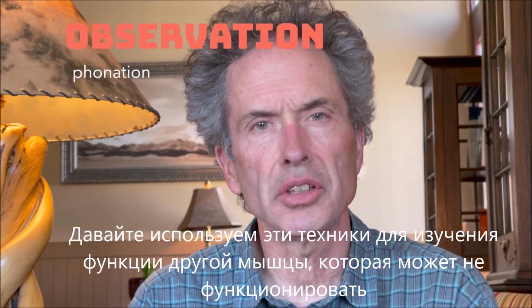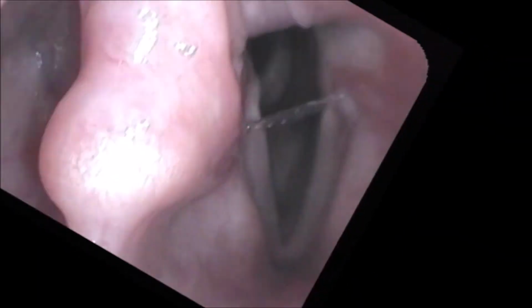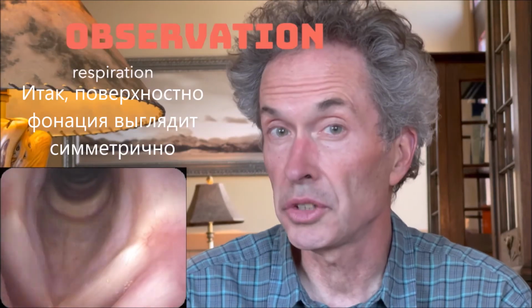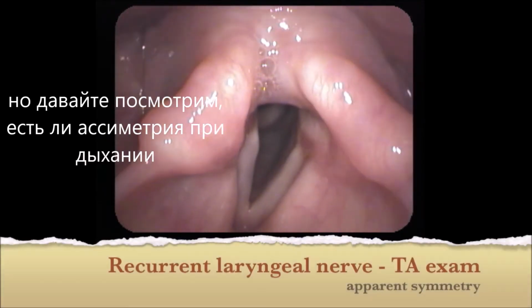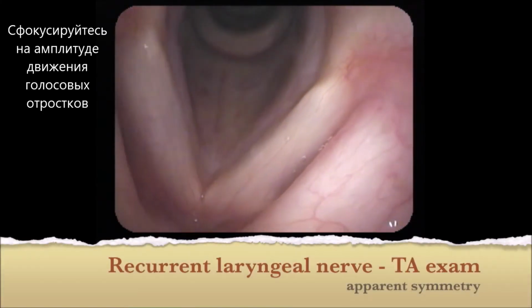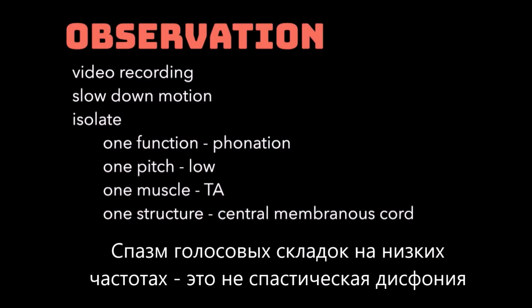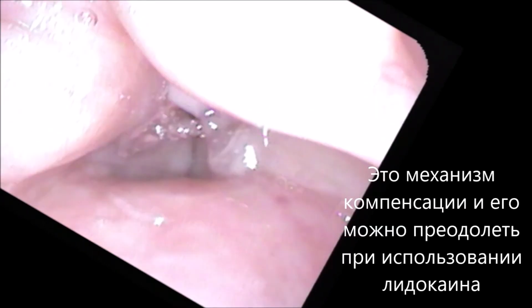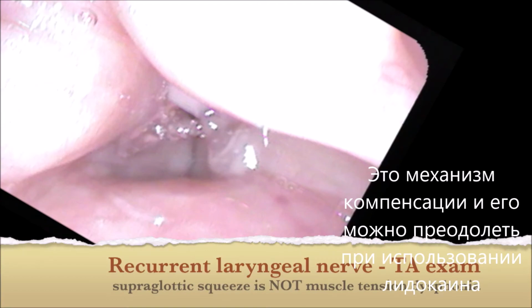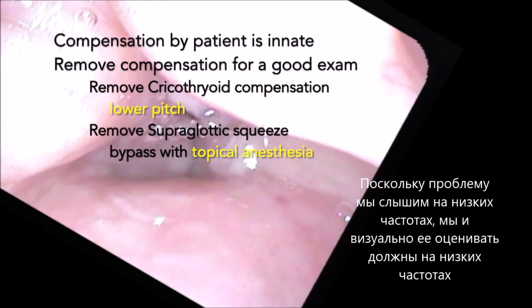Let's put a few of these techniques together to discover another muscle that's not functioning. Good, but low down. So phonation superficially looks symmetric, but let's look at respiration for any asymmetries. Focus on the range of motion of the vocal processes. Supraglottic squeeze at low pitch is not muscle tension dysphonia. This is compensation by the patient, and we can bypass this with topical lidocaine. We also hear the problem at low pitch, so we want to view the problem at low pitch.